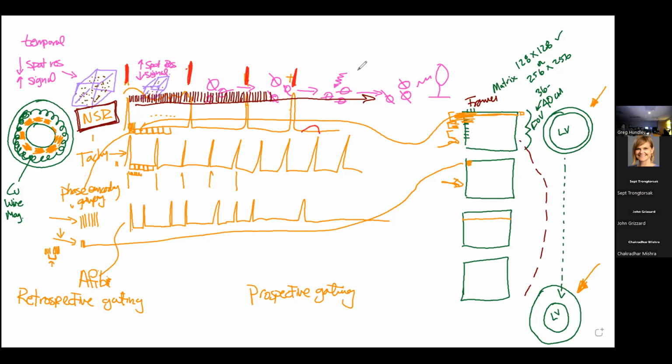Sometimes we use pulse gating. We trigger off the pulse. What the computer is doing is looking for some consistent trigger so that it can reorganize all of these guys coincident with the trigger that it's been assigned, whether that be the QRS or any of those things.